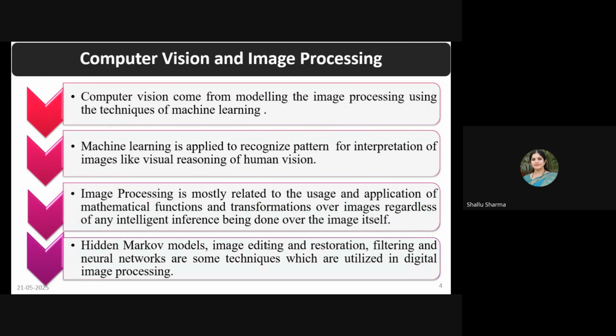This is the combination of computer vision and medical sciences in order to acquire information so that we can analyze biomedical images automatically, quickly, and with great precision. Imagine a computer interpreting X-ray, MRI, and retinal scans the way radiologists do. That's the power of biomedical vision. In order to make it successful, machine learning plays a very significant role in recognizing patterns just by visualizing the images. So image processing is the most important tool here.